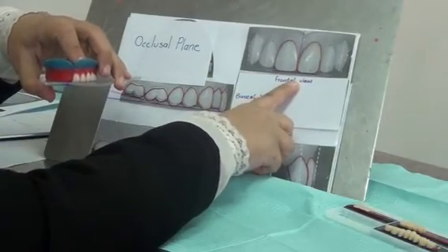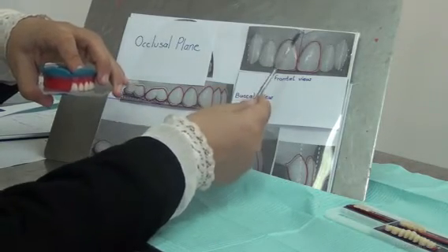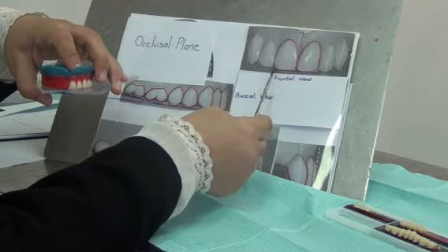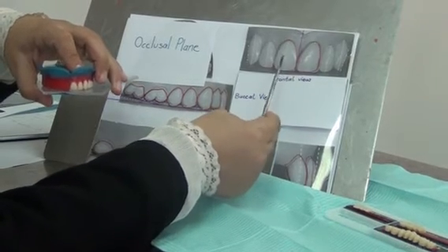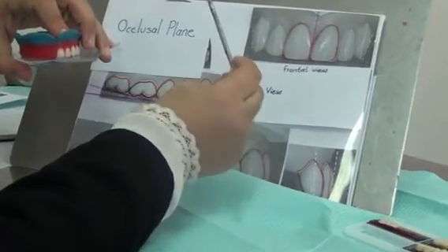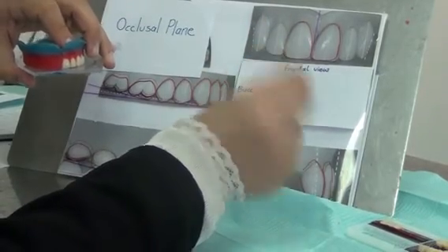When I want to look at them, I want to see that the midline is coinciding with the midline of the cast. The central incisors are placed on the occlusal plane perfectly. And once they are in this direction, we need to look at their angulation also in a moment. But let us first concentrate on which tooth is touching and which is not.